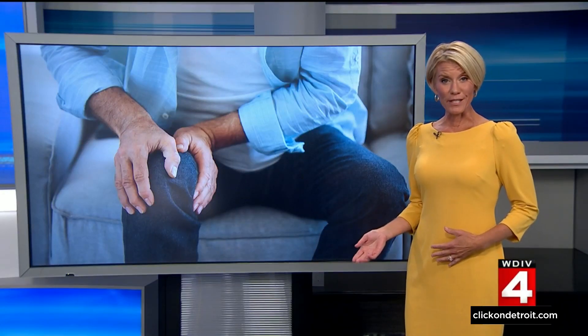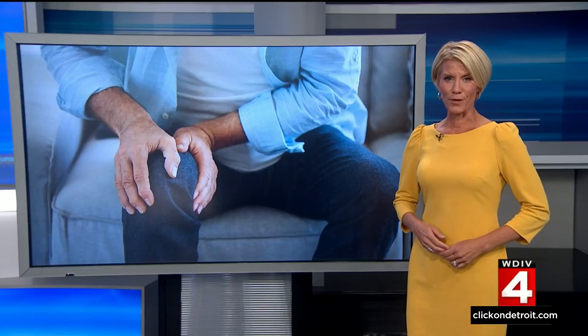If you are living with knee pain but not really ready for knee replacement surgery, there may soon be a new option for you. The FDA is reviewing a minimally invasive device that could help patients with osteoarthritis get back on their feet without major surgery.